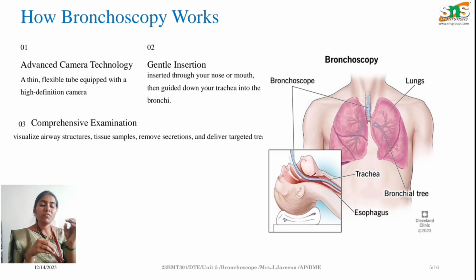So if it is treatment, we can deliver direct medication, or if you want to remove any sort of blockage in the airways, we can do that with the help of catheters and so on. So many tools are there. With that we do treatment, or we can do diagnosis. We can easily collect the samples and send them to a laboratory for further analysis, to check what type of infection has happened there, and what stage that particular disease is at right now.